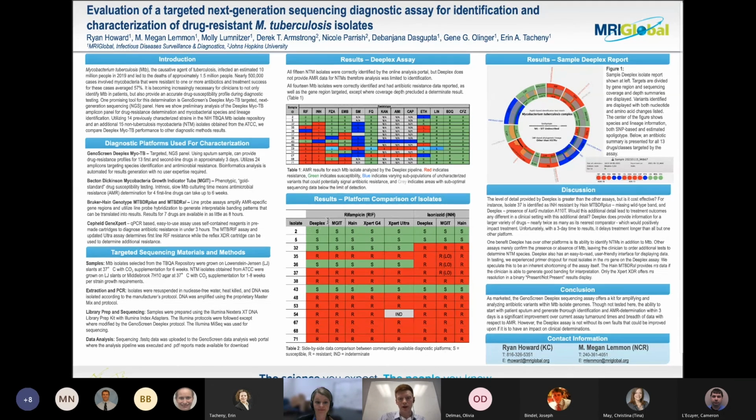So you see here, for these other diagnostics, we were able to compare two drugs, and some of them have more information, but we couldn't do a whole characterization of everything that's output by the D-plex assay to just one or another commercial diagnostic. It's a lot more than that.